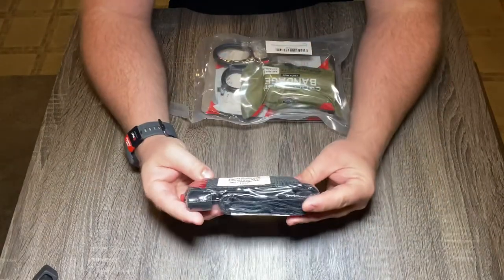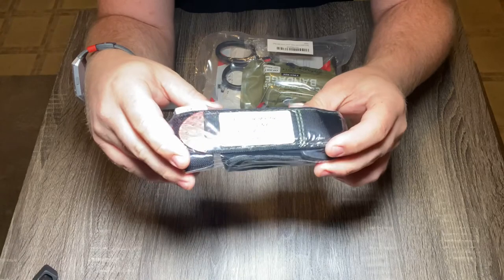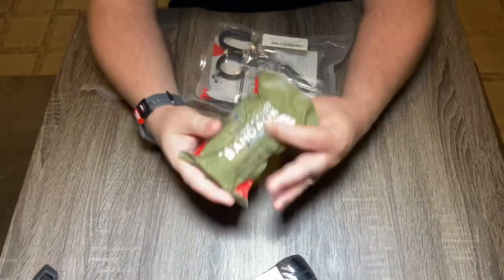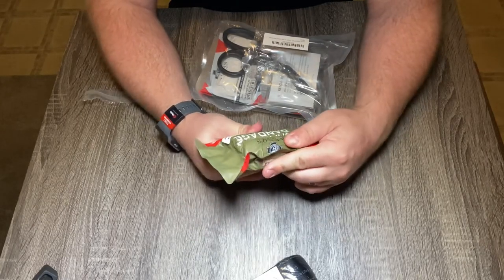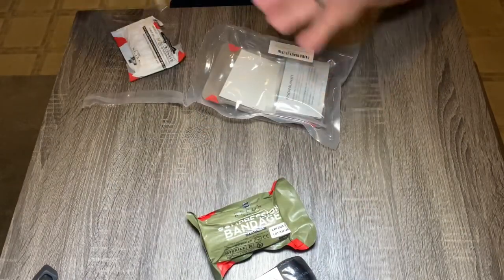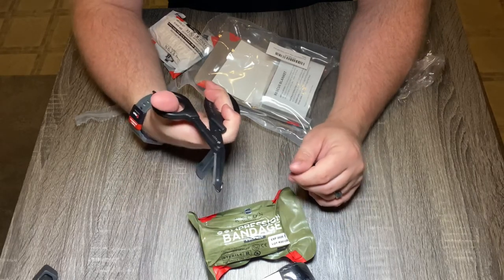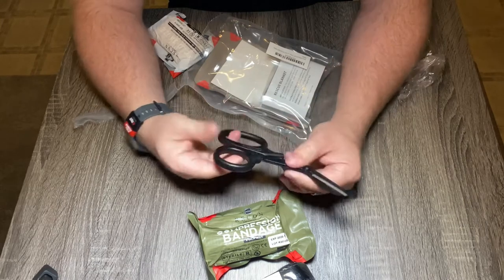After opening the package, the first thing you'll see is a tourniquet. And this is their version of an Israeli bandage — a compression bandage. And then it does have these trauma shears, which seem like they're really good quality. It's really easy to come across cheap trauma shears, but these ones I kind of like them.